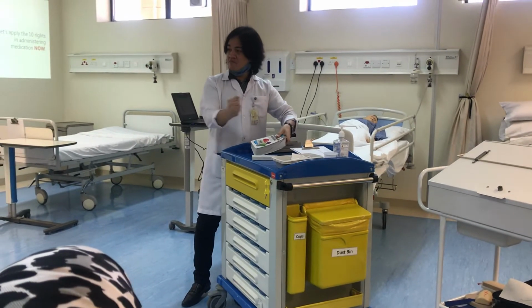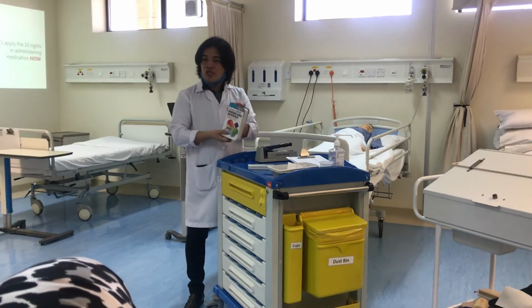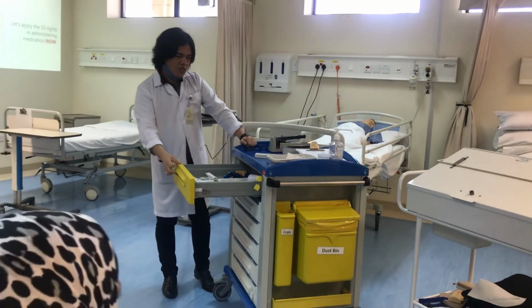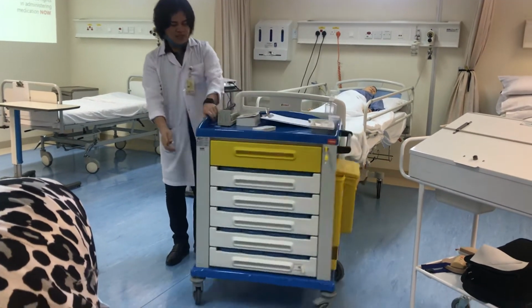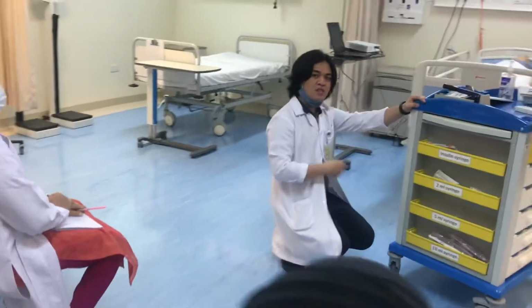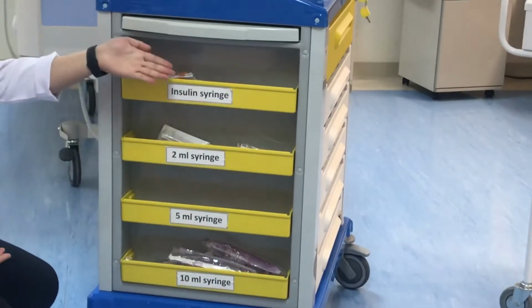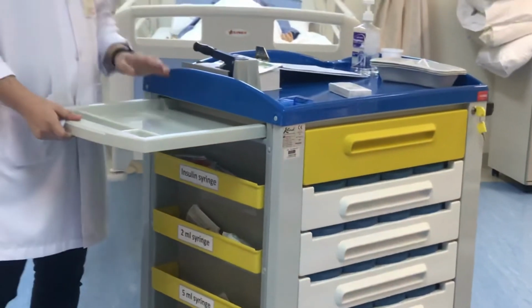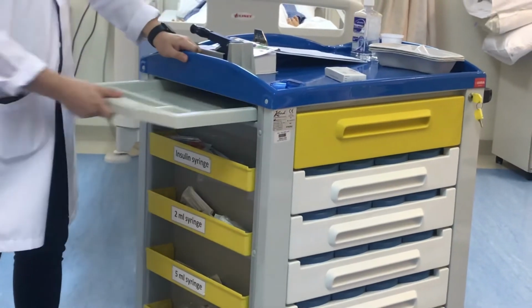They have a mortar. Normally our medication trolley should have a drug reference handbook. Even in the hospital, they have. They would also expect some syringes on this side of different sizes. This is very important, especially if they start learning the injection. So the different syringes are here. It should be arranged well. This one can also be used in preparing, if you have a lot of medications to be prepared.